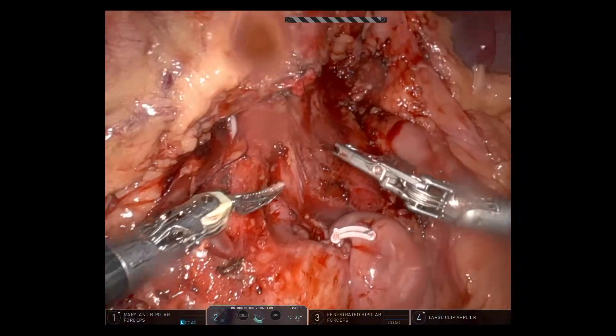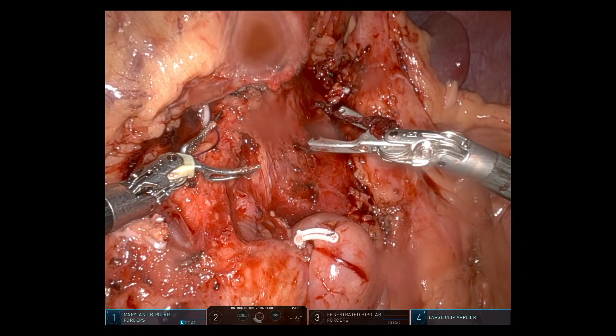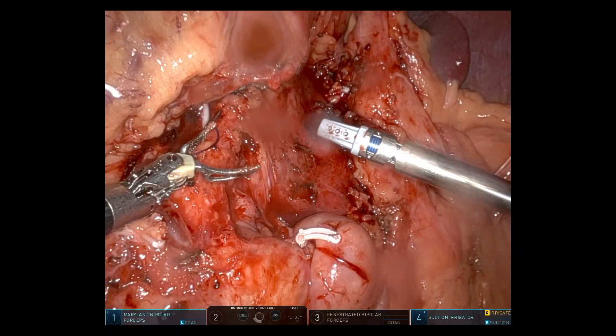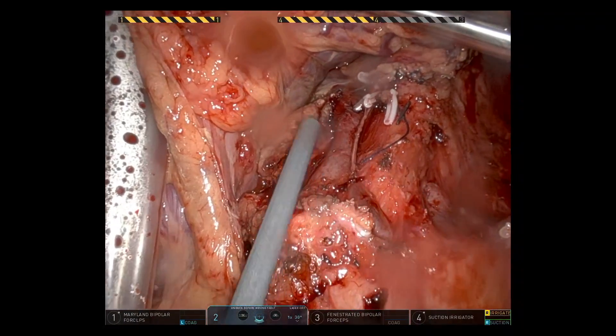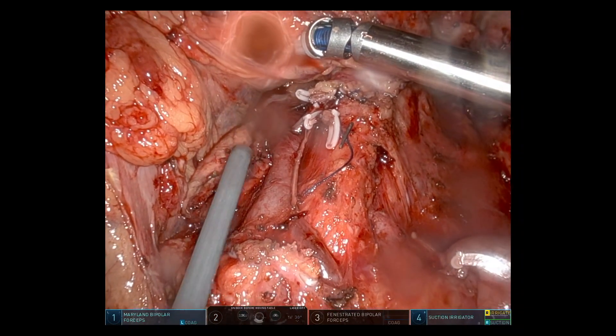There was a lymphatic near the SMA leaking some lymphatic fluid, which I clipped — and it all looked nice and dry. You can see the border of the pancreatic neck that has been stapled across.